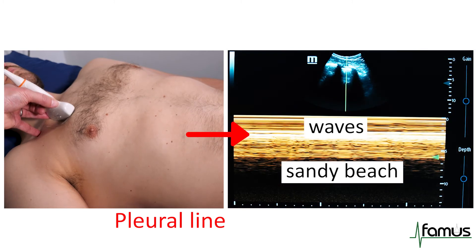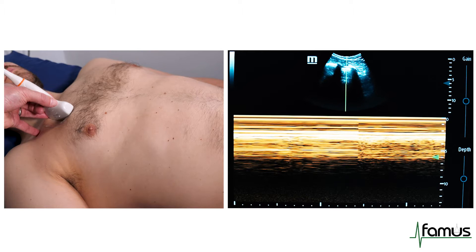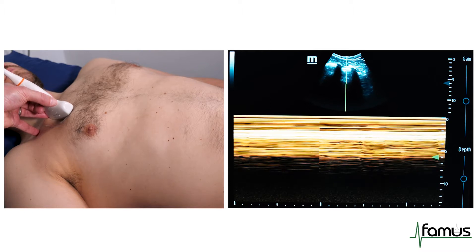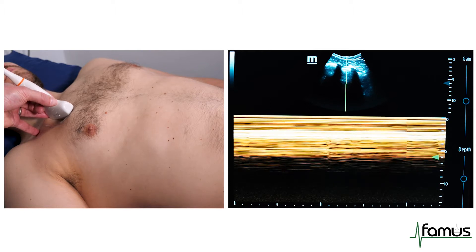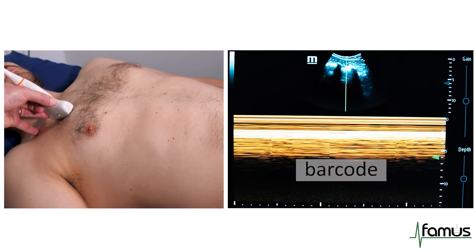As our model stops breathing, we can see this become the so-called barcode or stratosphere sign, where the sand on the beach below is replaced with horizontal lines.